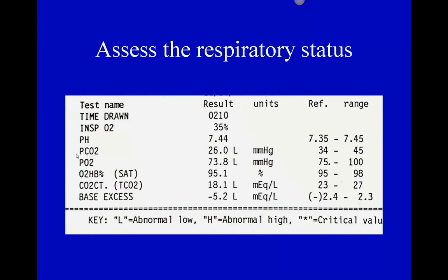Let's look at this patient then. Their carbon dioxide level, not to be mixed up with this one. We're looking at the pressure one, the millimeters of mercury one. Do they have a respiratory alkalosis or acidosis? I want you to answer that question.